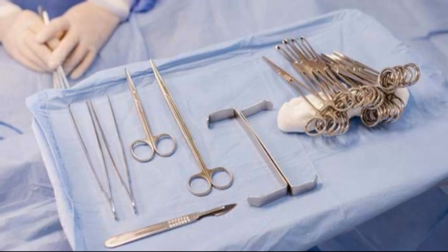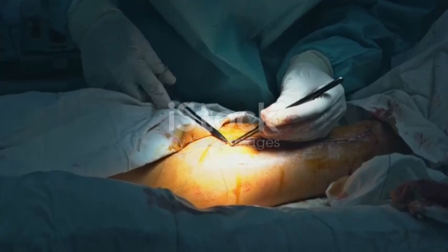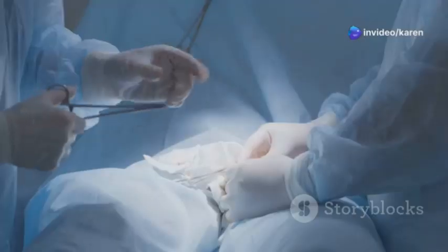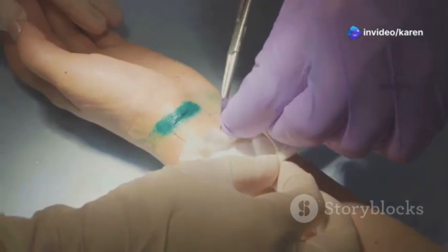There are two main types of sutures, absorbable and non-absorbable. Absorbable sutures are broken down by the body over time. Non-absorbable sutures remain in the body permanently. They need to be removed later.